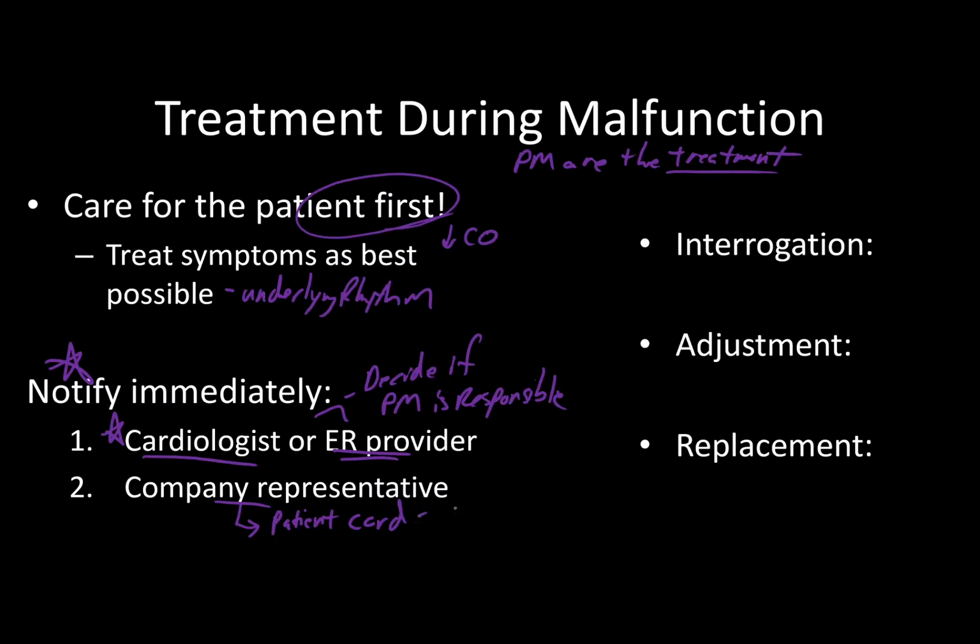And that card's going to say what brand it is. And it may even say what function that the card has been placed under. Or, sorry, the card should say at least what brand of pacemaker the patient has and potentially the functions that were set up on it so that you can have a better idea of what's going on.